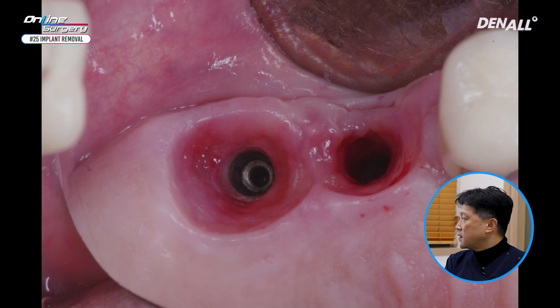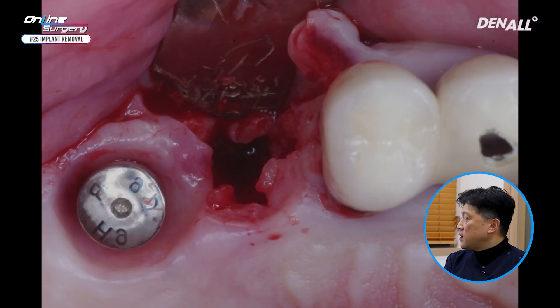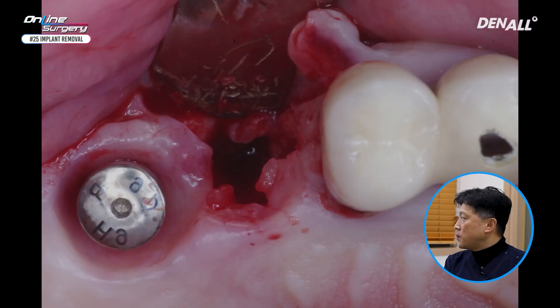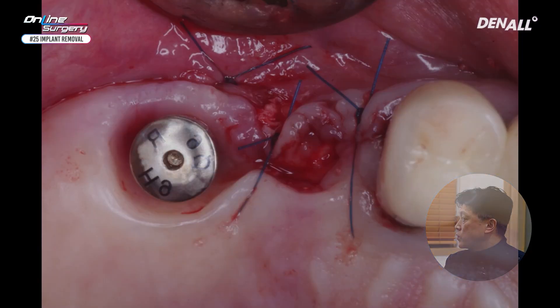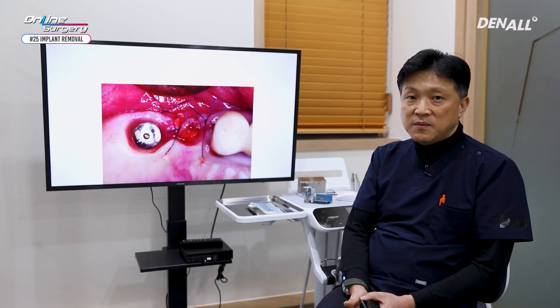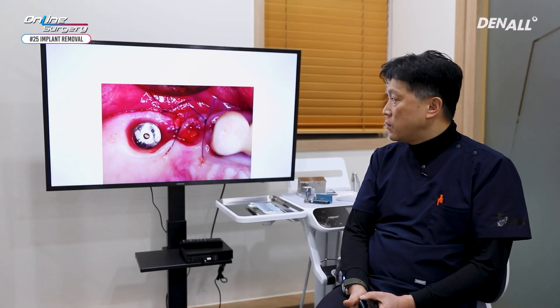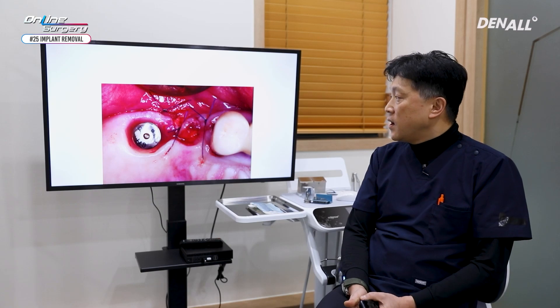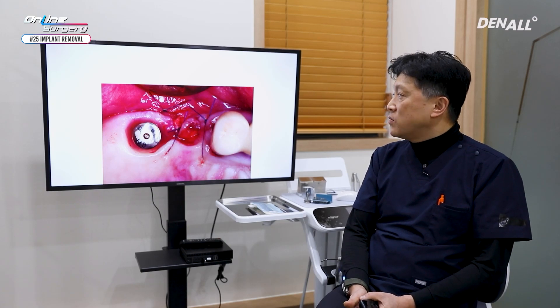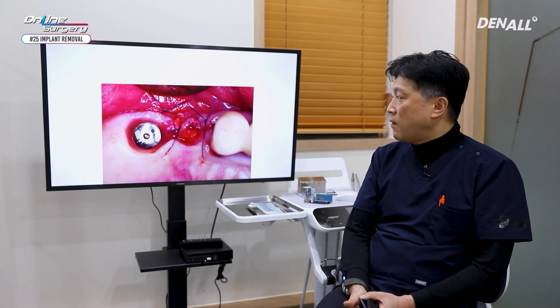If you look at the adjacent gingiva, there was slight inflammation as well. After implant removal, during which the flap was reflected in a minimum way, collagen membrane was used after bone grafting, suture was done, and the case was complete.